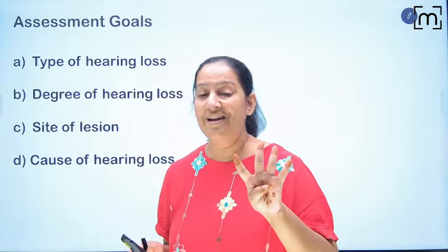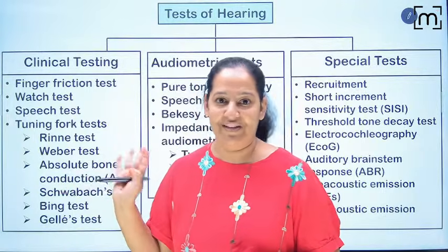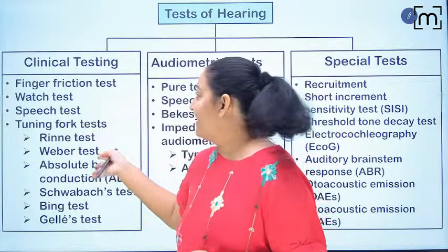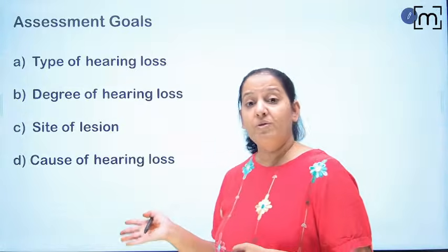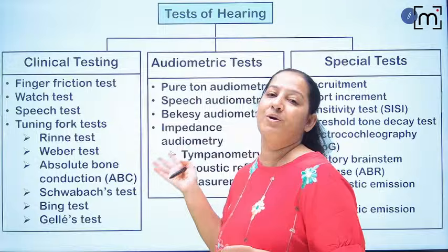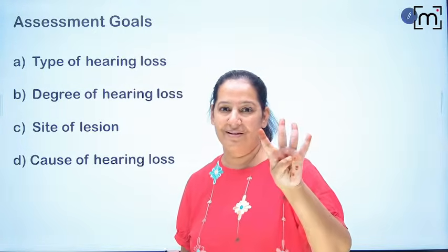What are the 4 goals? Why do we want to perform the test? How will the tests come? My next slide is the tests only. I will teach you all these tests one by one. We will do clinical tests, audiometric tests and special tests. But before that, why do we want to perform all these tests? There are 4 goals.